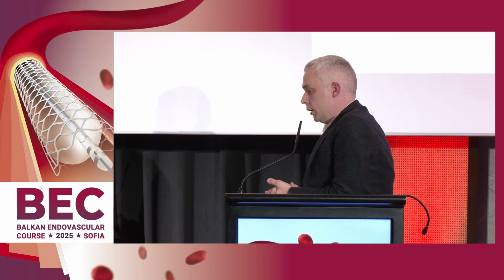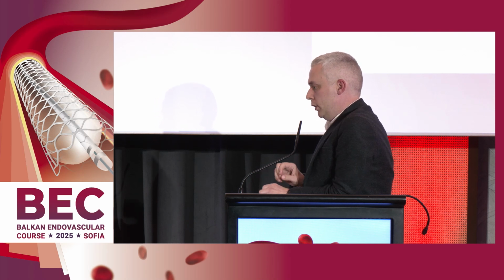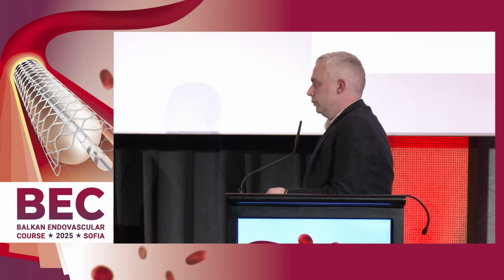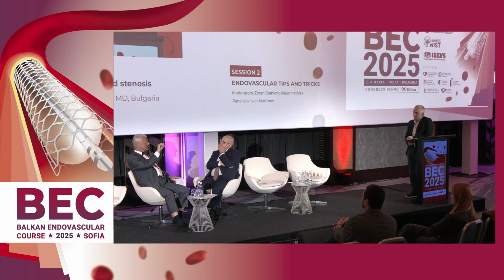In this patient, we also used a very stiff tip wire, a CTO wire, and we also used the catheter for support, which makes the wire extremely stiff. What is also helpful is to use a balloon-tipped sheath, so that before you pass the internal carotid artery, you can block the flow completely, for anchoring.